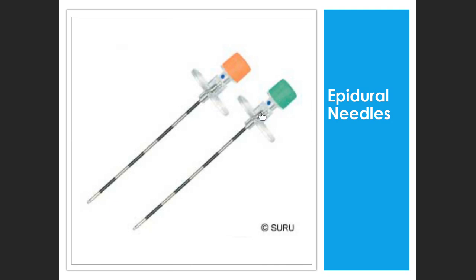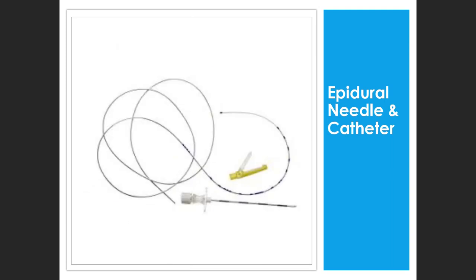Another 2 to the tip, to the opening of the needle. That would make it about a 10 centimeter needle. It's color coded again, depending on size. And an epidural catheter is placed through the needle. The first marking on the catheter is at 10 centimeters, and then they're 1 centimeter apart. The double marking would make 20, and so you go.